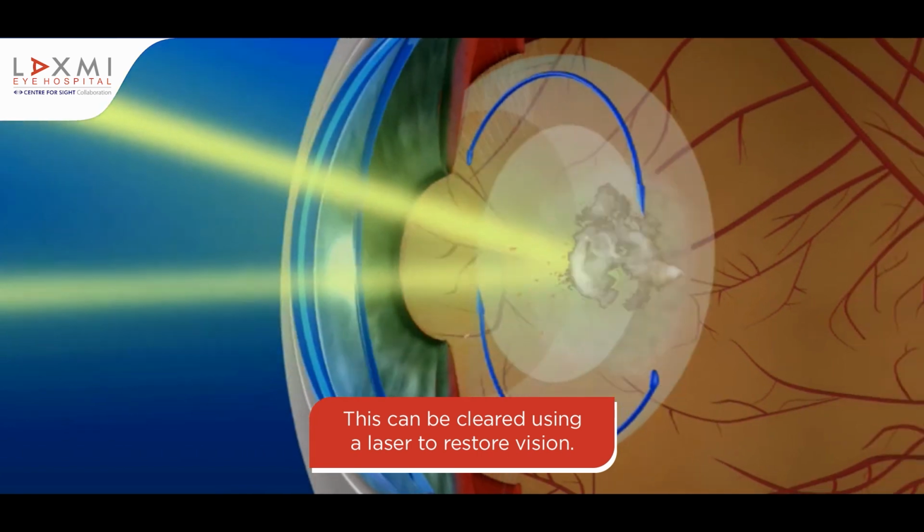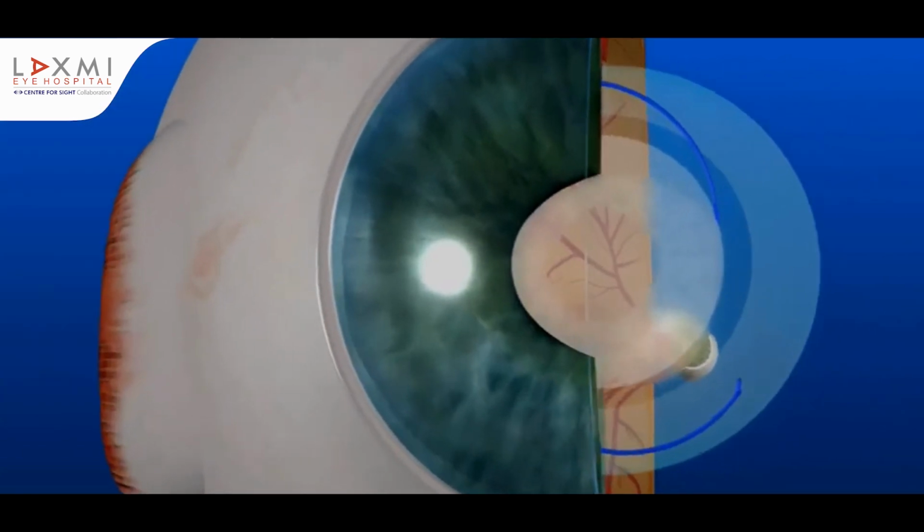It's called capsulotomy. And so we advise our patients after the surgery, as a routine, to come for regular follow-up, because it is in the best interest of maintaining good vision for a long time.